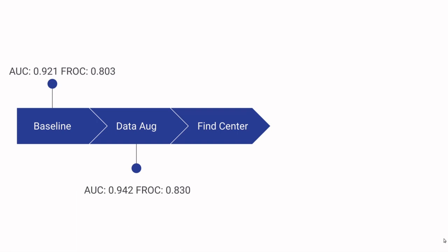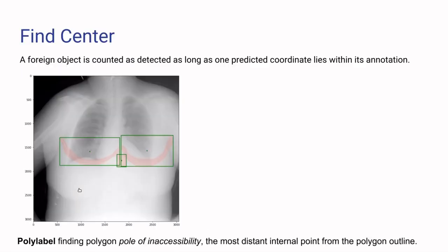Unfortunately, this presents a problem: many of our annotations are polygons, where the center of the simple bounding box is outside of the annotation, as shown in this picture.